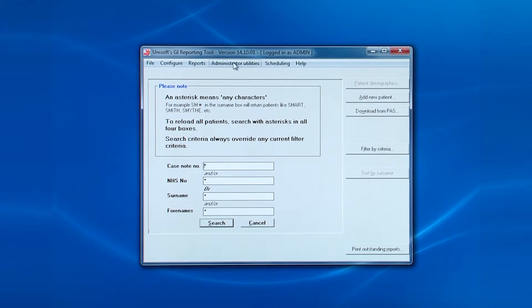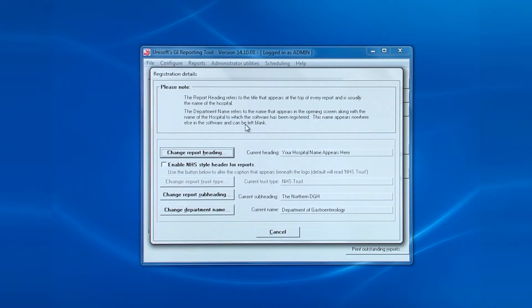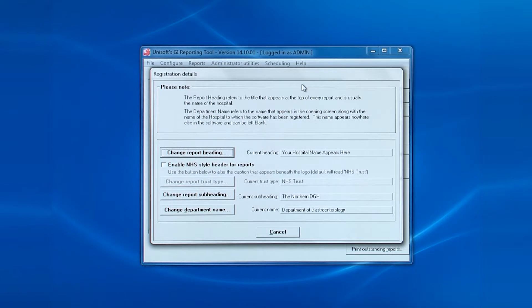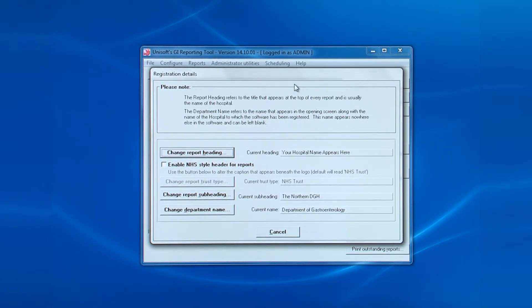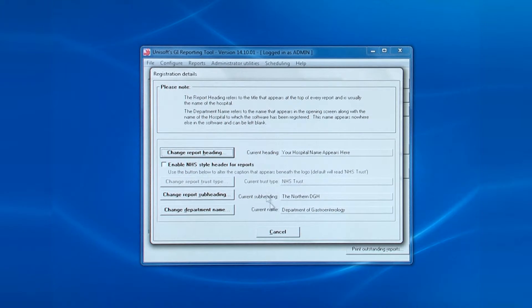The next entry is for the registration details. This allows you to change the heading on the report, the trust type, the report subheading and the department name, and that latter item only appears in the splash screen at login.